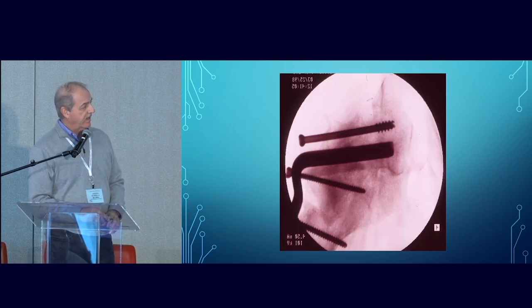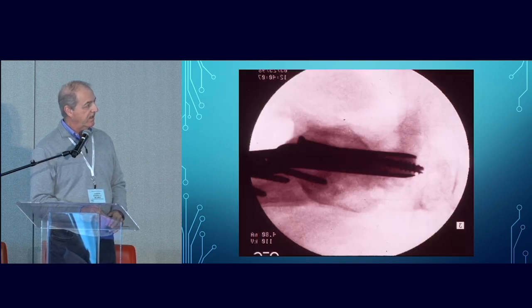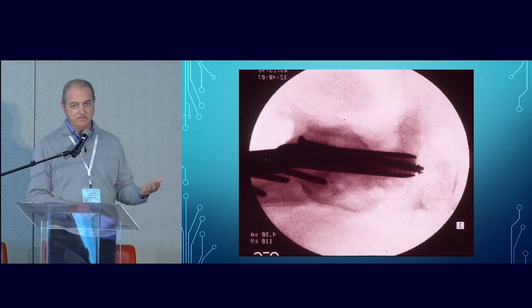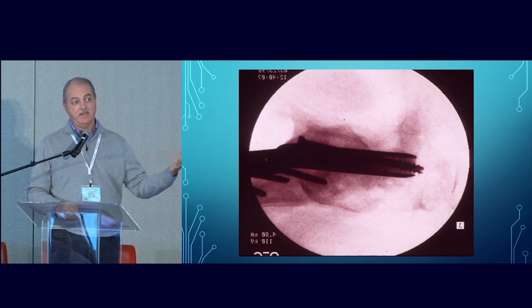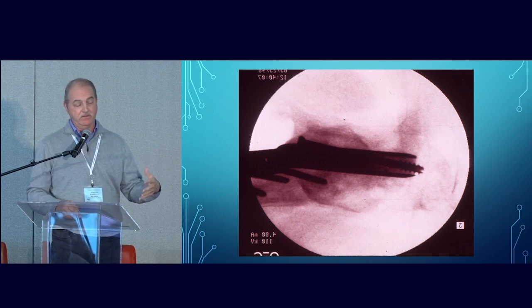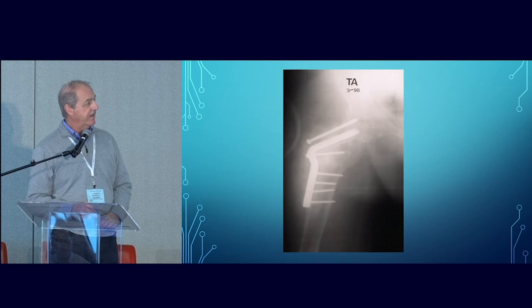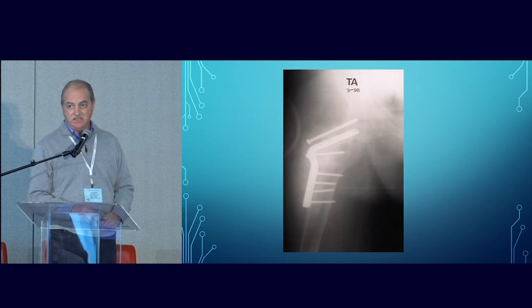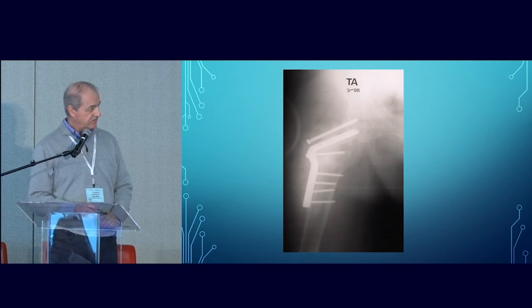And here we are intraoperatively. The osteotomy's been done. The plates and screws are in. Here's a nice lateral. This is probably a 120-degree blade plate. Make sure that blade is in the femoral neck and head. Remember, some of these were being done years ago without any fluoro. They would shoot plain films or just eyeball it. Personally, I need fluoro. And then here the patient is done, quite nicely healed. The head's still alive miraculously, and he has a reasonable hip at a relatively young age.